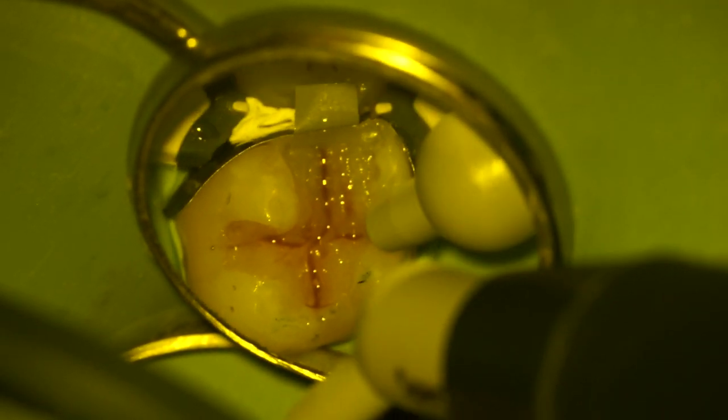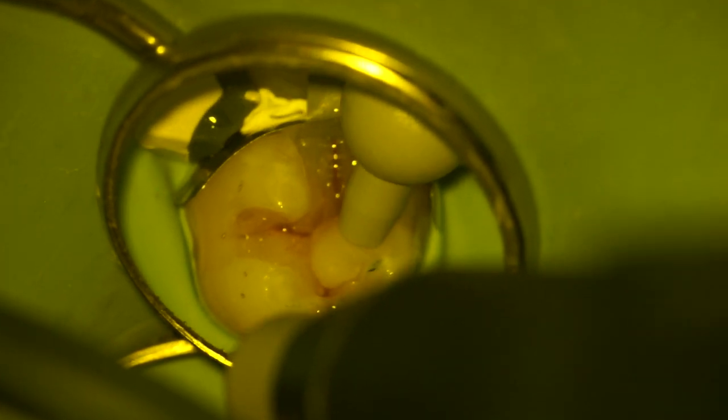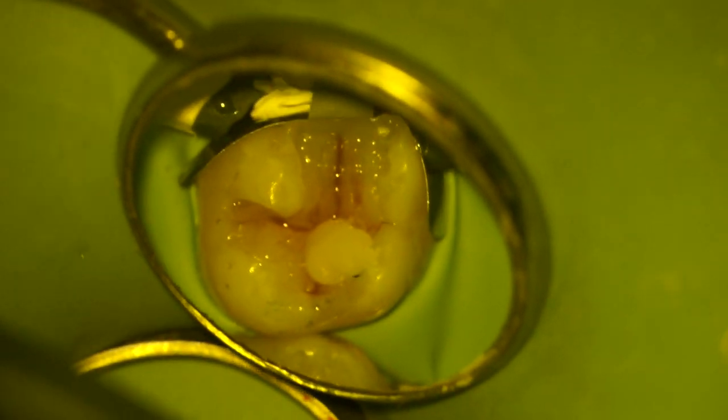And we are slowed down again. The base has now been built, and I'm going to show you the time it takes to simply shape the final layer of one cusp.